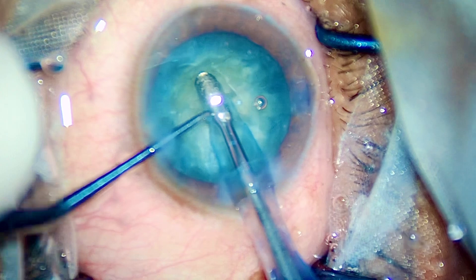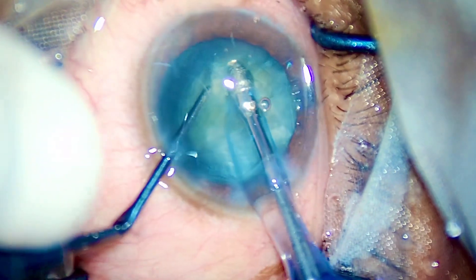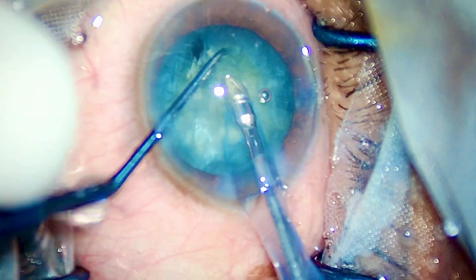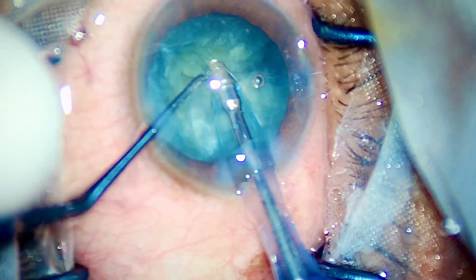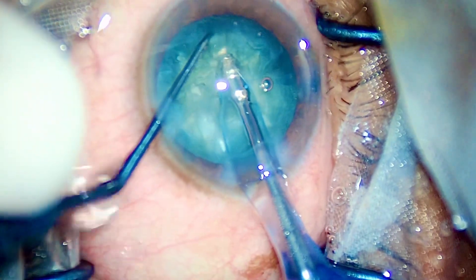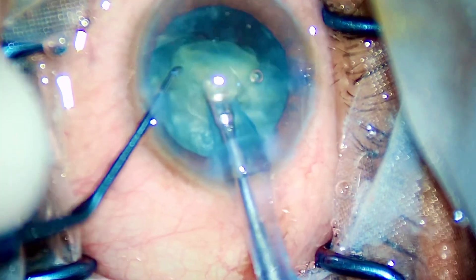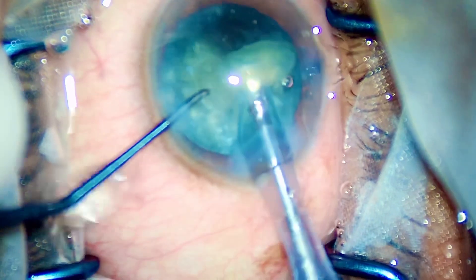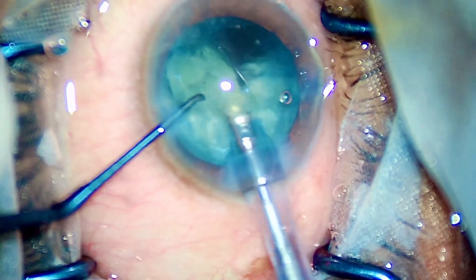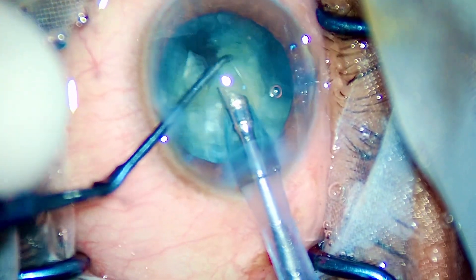I am using minimal FACO energy — around 30 to 40 percent in pulse mode. Here you go, chop again. By now I have made around four pieces, and I'll make even more — and there goes the fifth piece. What I need to do right now is take one piece out and make space so that the following pieces can come through into my FACO tip.